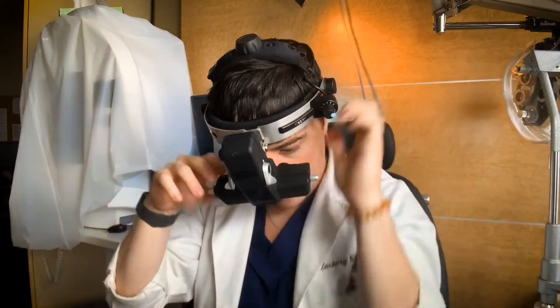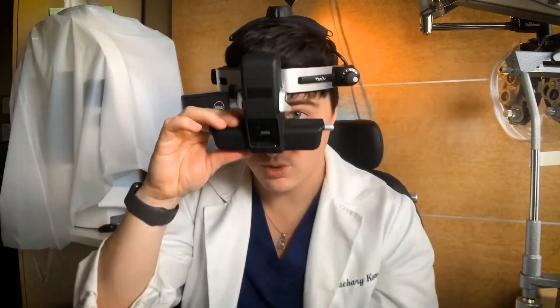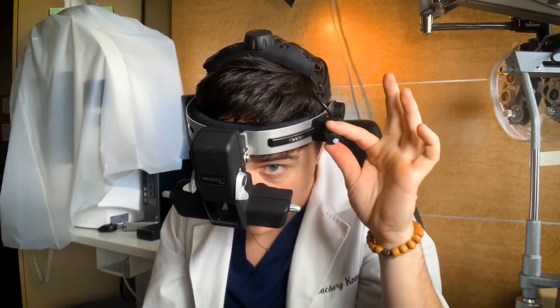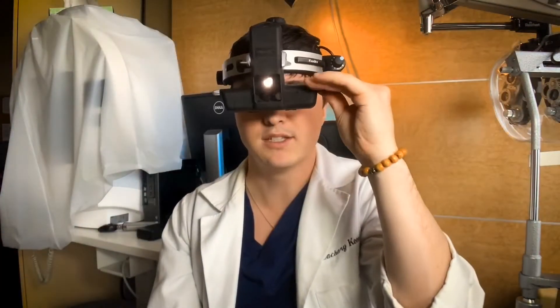The next step is to adjust the oculars to get a binocular view — meaning you're seeing out of both eyes at the same time, which you need to see in three dimensions. Put it on, turn it on. The knob here adjusts the brightness from all the way off to low light and up.